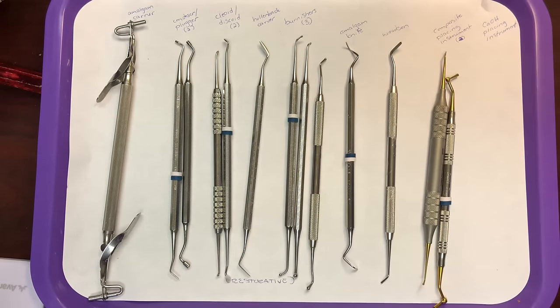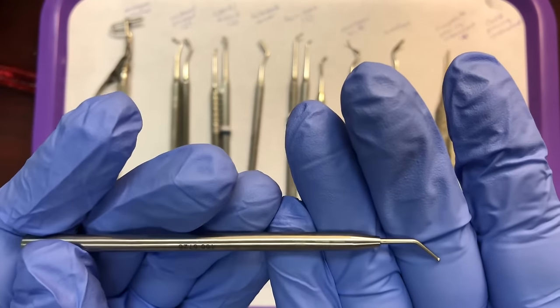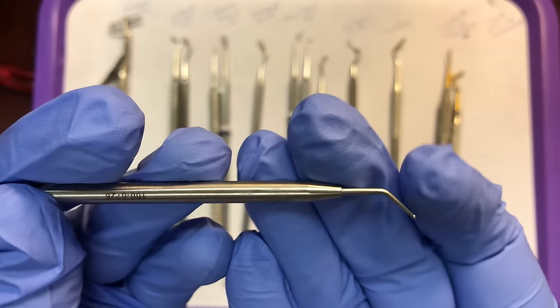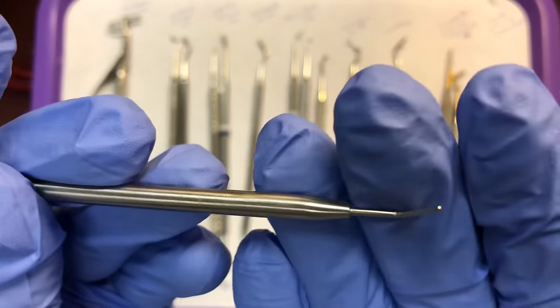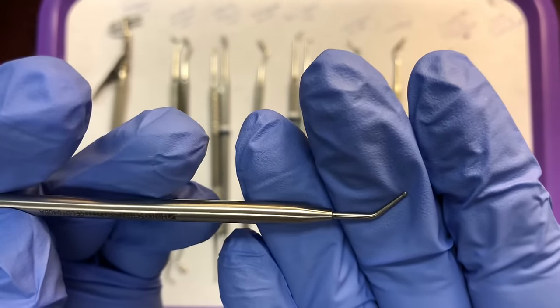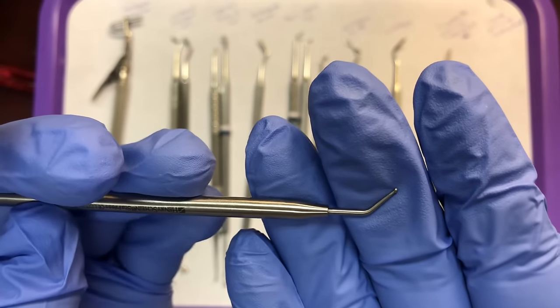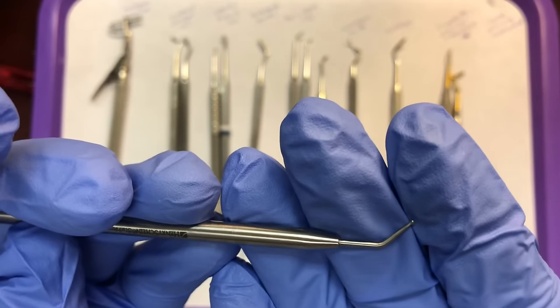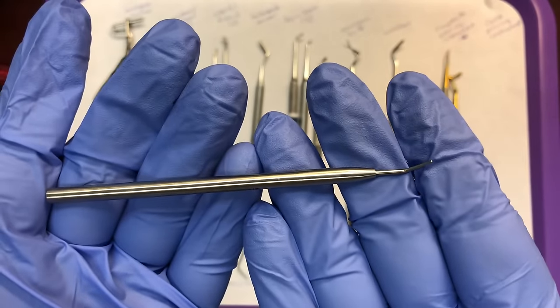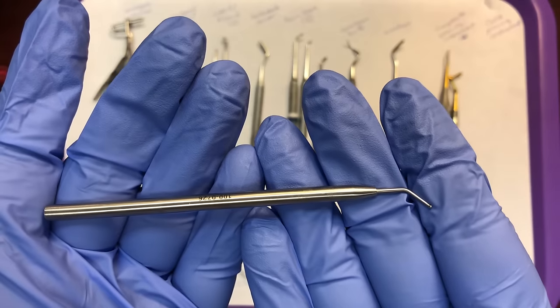The last one for the restorative setup is the dycal placing instrument. This instrument is very small and short compared to others, single-ended, with a tiny ball at the tip. The dycal placing instrument is used to mix and place dycal, which is a type of liner. You could also call it a calcium hydroxide placing instrument — dycal is the brand name, calcium hydroxide is the chemical name. It's used to mix and place calcium hydroxide or dycal.